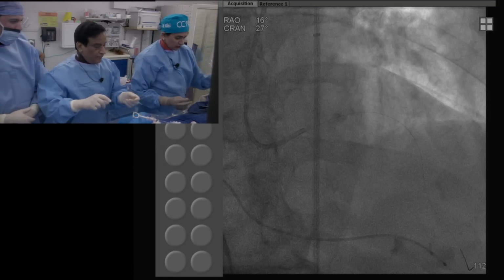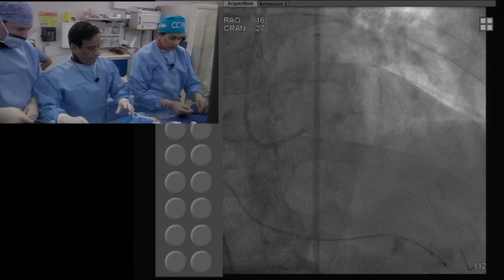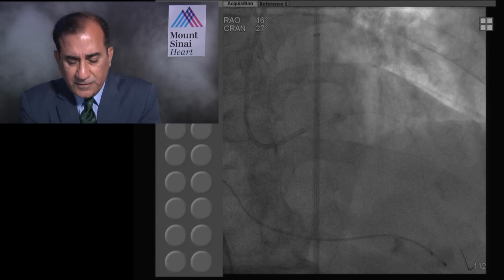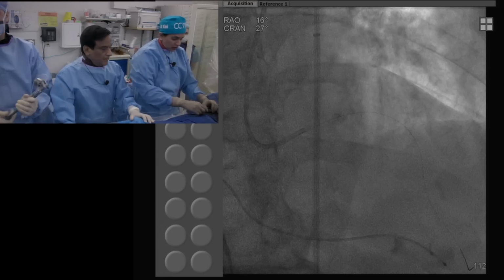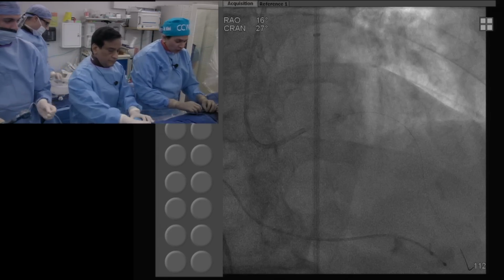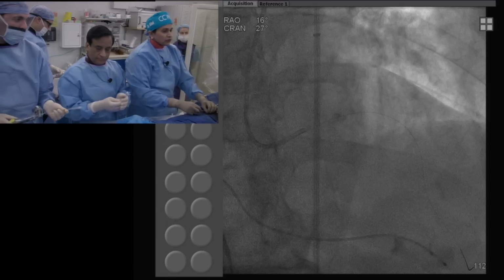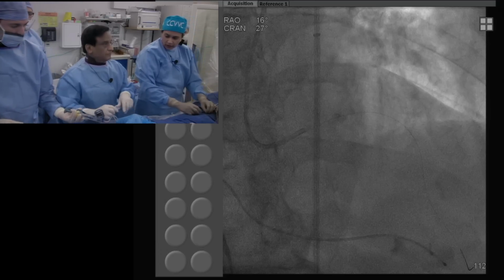So, 3 years is a very short time. Anu, a question has come through: do you have a preference for IVUS or a particular stent in view of the aneurysm? What is the stent selection? Nothing particular. Ideally you want to close it, so you probably have to go with a covered stent, but covered stent has very high restenosis, so we are definitely not going to do that.